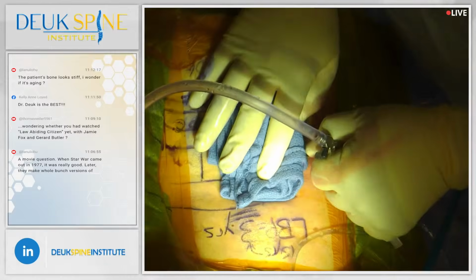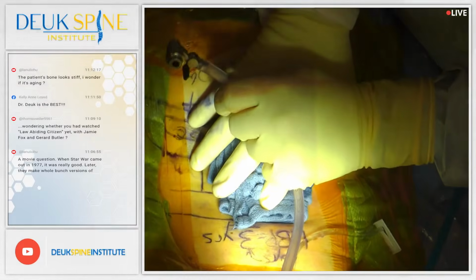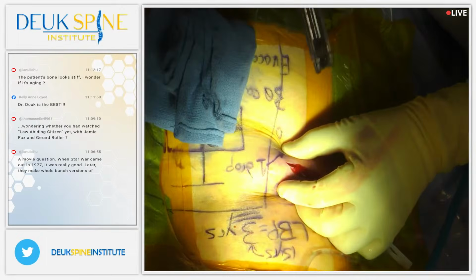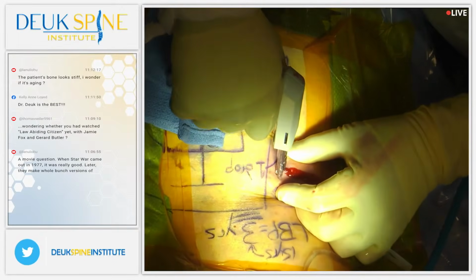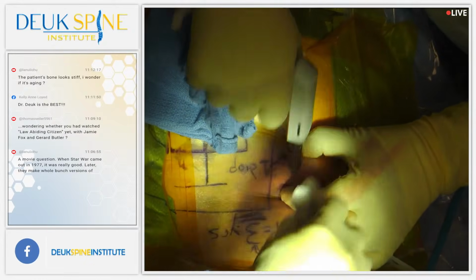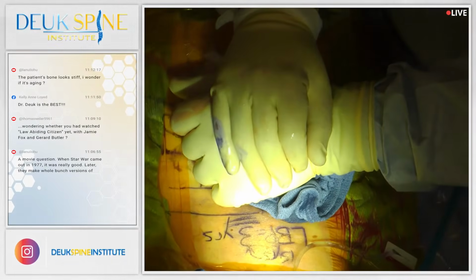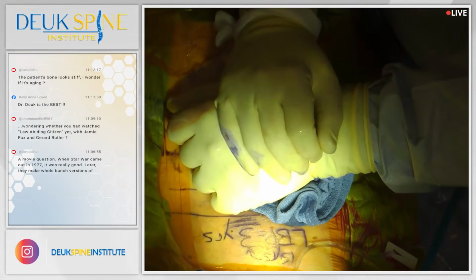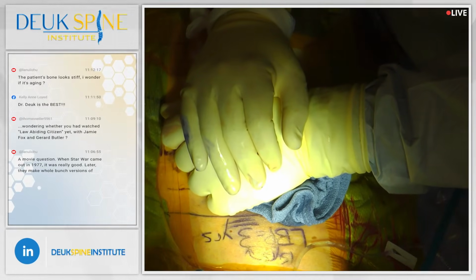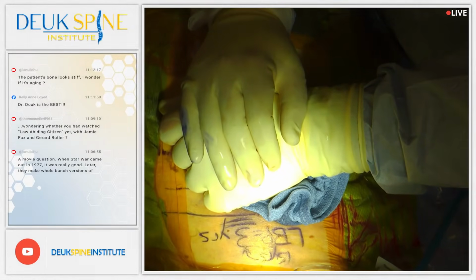All right, coming out. We're done. Like I said, he's got a few other causes of back pain that we'll address in the future for him. But this went well. It was very difficult for the anesthesiologist, very difficult for me because the disc space was so collapsed, and he was cramping down. His muscles were just so tight, pushing down on the disc and squeezing my endoscopic tube and just grabbing it and holding it. Anyway, we're done. Any other questions? Yeah, we got a good discogram.